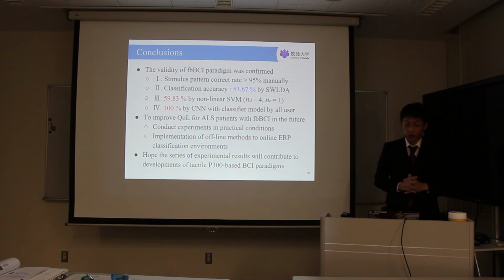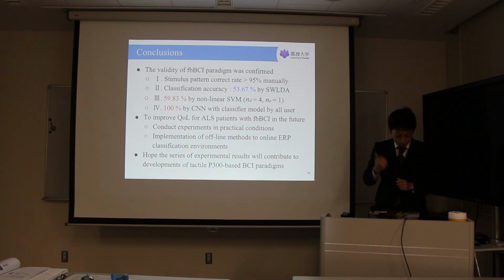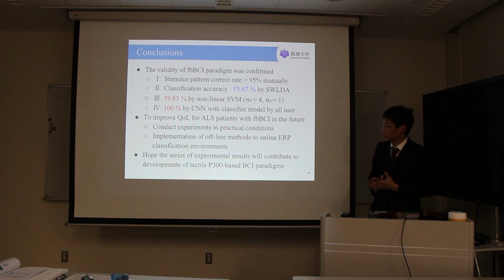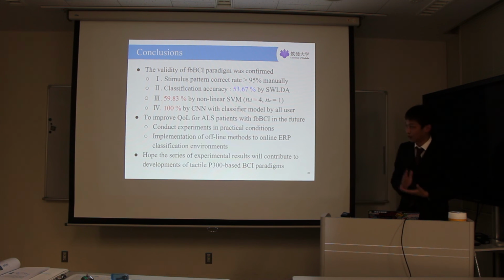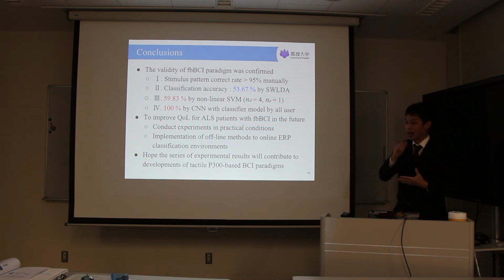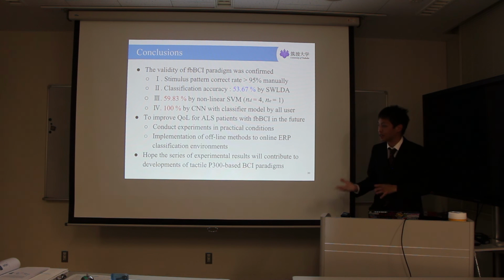In future study, we need to improve the QOL to help ALS patients. With this modality, we need to conduct experiments under practical conditions, since we haven't applied this modality to ALS patients.